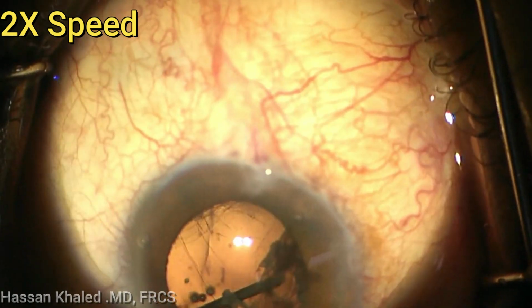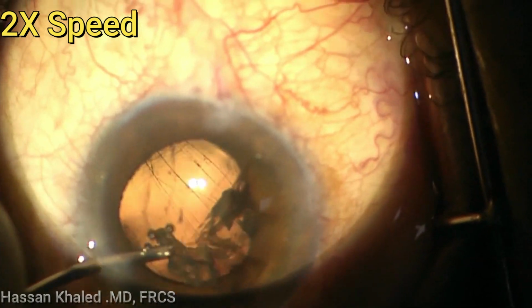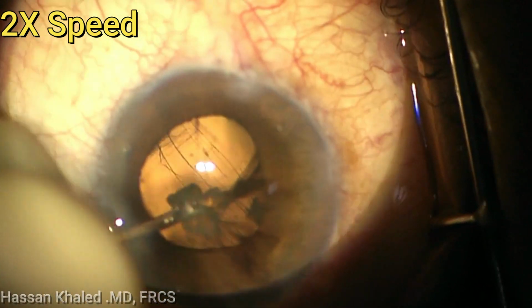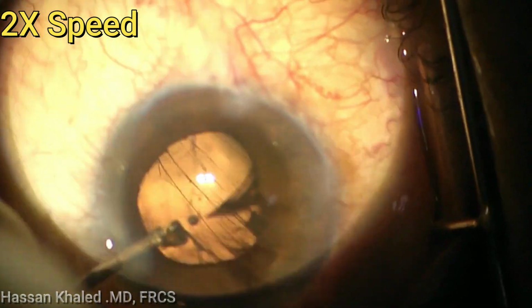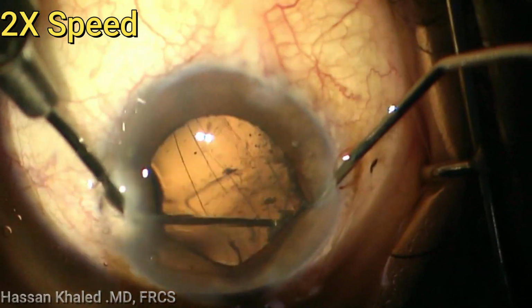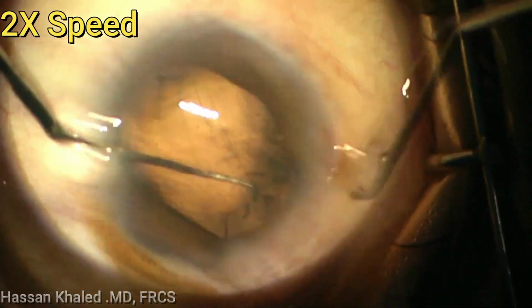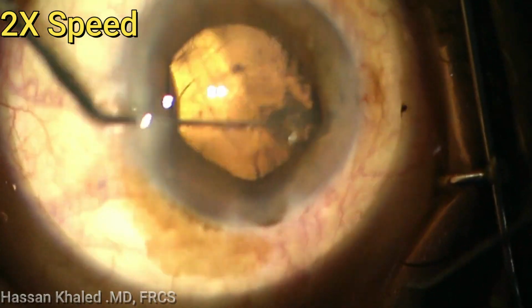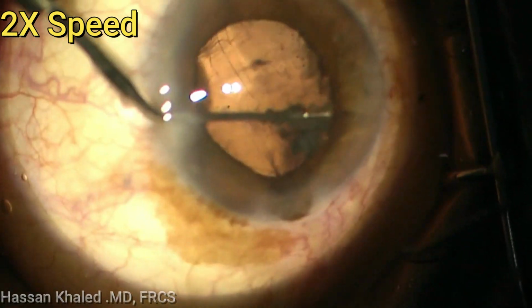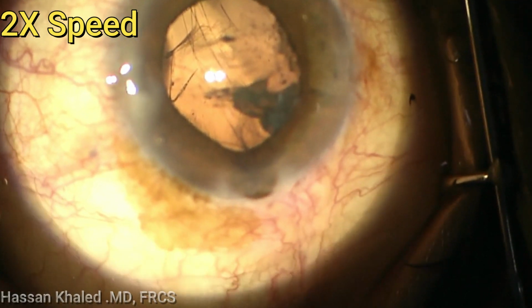Again, you can see this is a large cortical piece. Injecting the dispersive OVD behind it and trying dry aspiration of this cortex using the large cannula connected to 5 cc. Again trying to get this cortex anteriorly using the Sinskey and moving the iris with the shoulder.